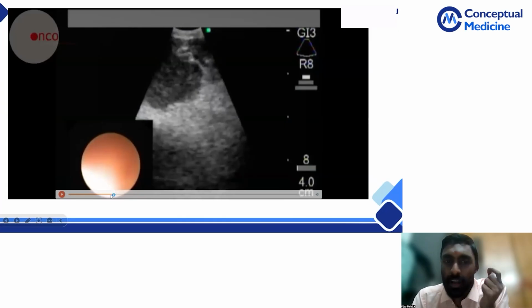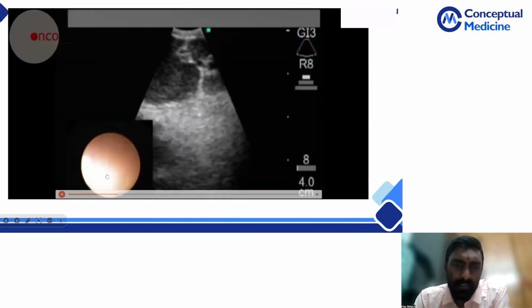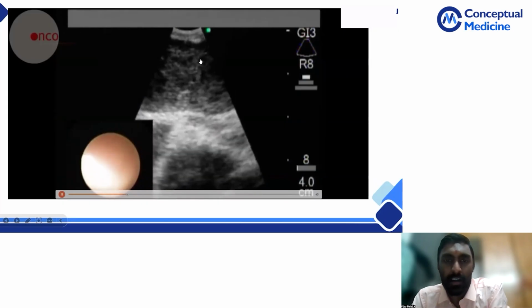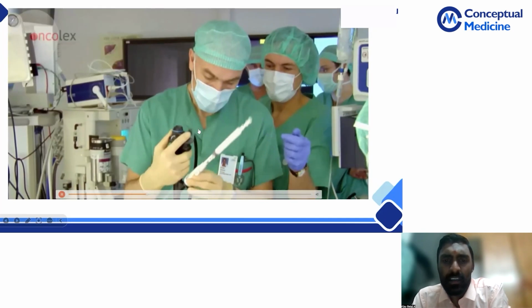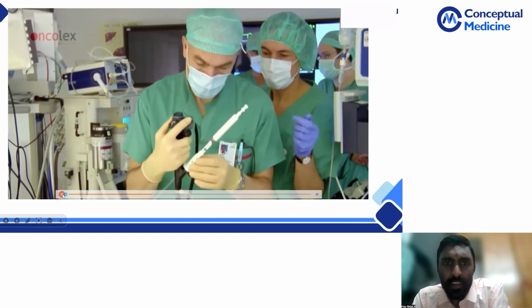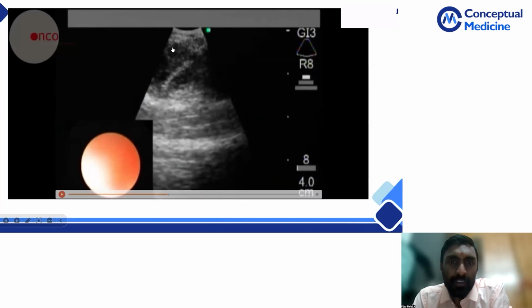So what they are doing is you are having a bronchoscope, a normal bronchoscope, and the tip of it is having an ultrasound probe attached. You are going to see the airway like this. If you're not finding anything, you will activate the ultrasound. You are going to see the node that way. You will take in a needle there. This is a needle, and as you're seeing there, you see that? So once you screen the node this way, you can pass the needle through and through.